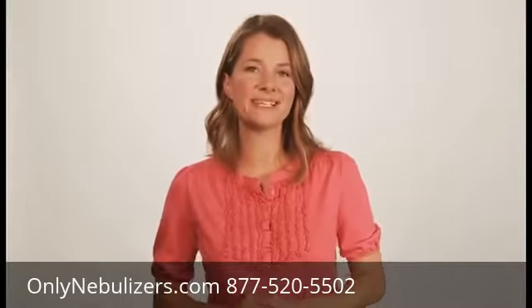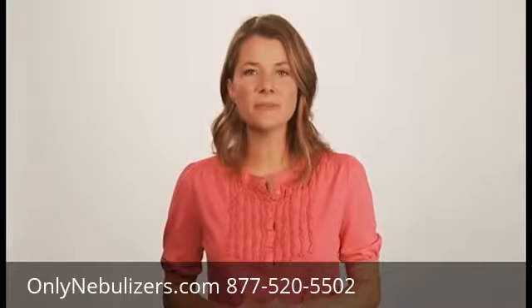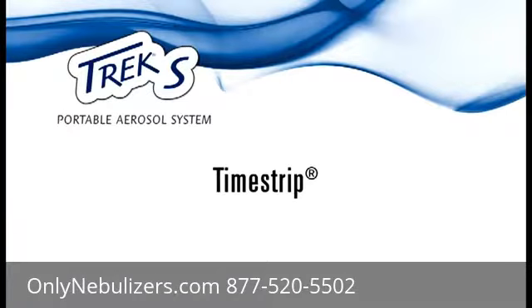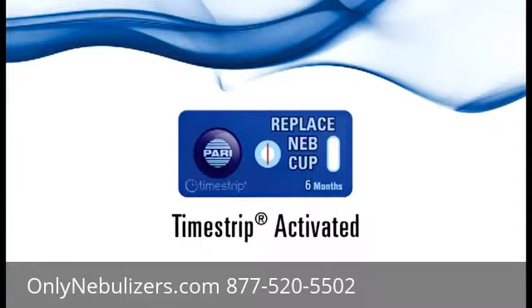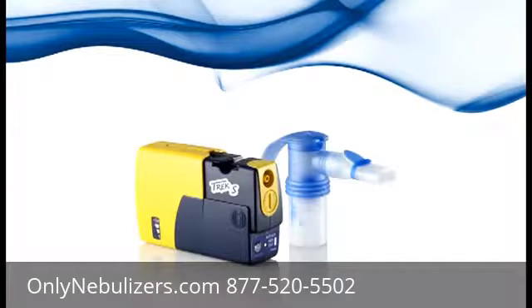Pari makes it easy for you. Included in your nebulizer pack is a time strip. To activate, squeeze the bubble on the top of the time strip. A red line will appear in the small circle within one to two minutes, indicating activation. If you do not see the red line after three minutes, press the bubble again. Remove the adhesive tab on the back of the time strip and attach the time strip to your Trek S as indicated here.